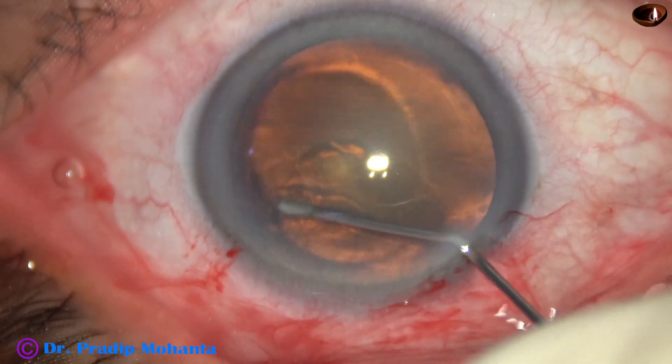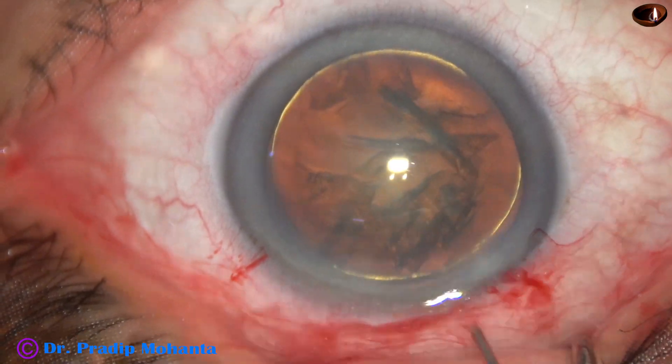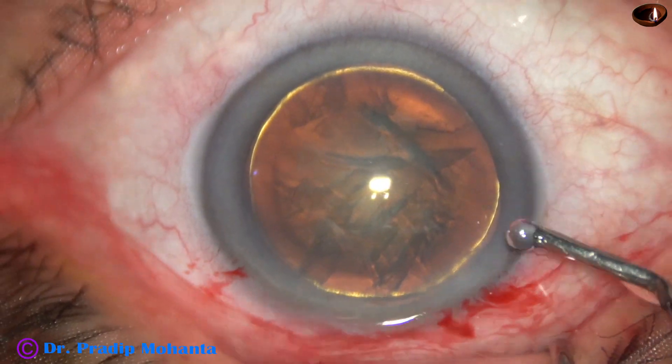This is hydrodissection, and hydrodelineation has also been done. Hydrodelineation has produced a beautiful golden ring in this case.